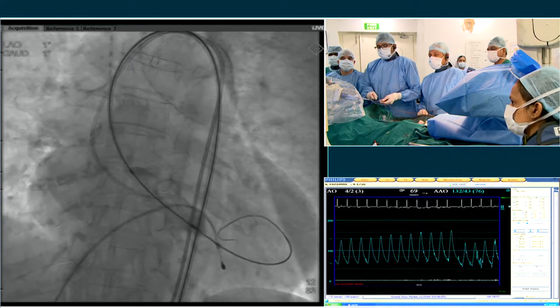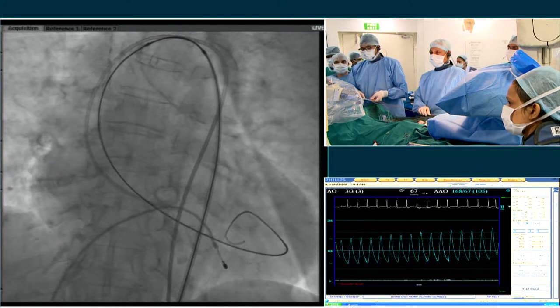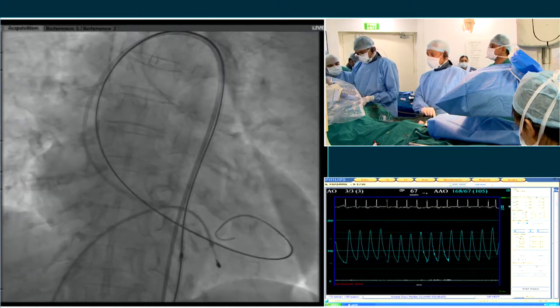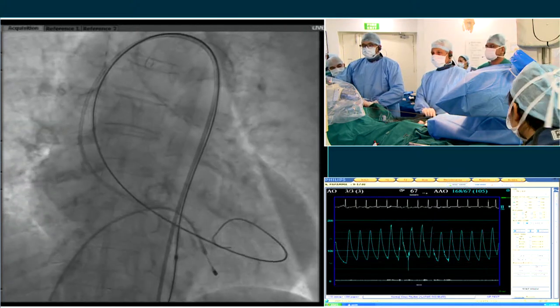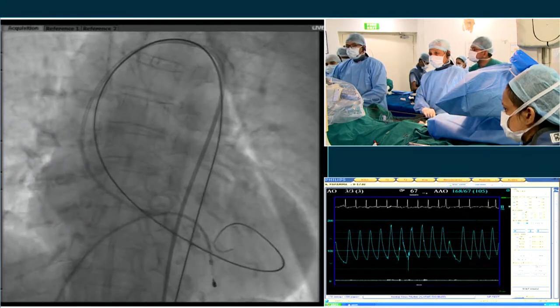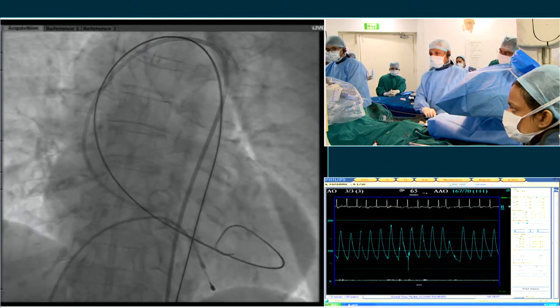Yeah, it expanded nicely. So we took a 21 and a half and we added a cc and a half. So I guess the question is, can you hold negative? Will I pull this out? Hold negative. We could have taken a 23, taken volume out. Here we elected to do, as I said, a 21 and a half and add volume.